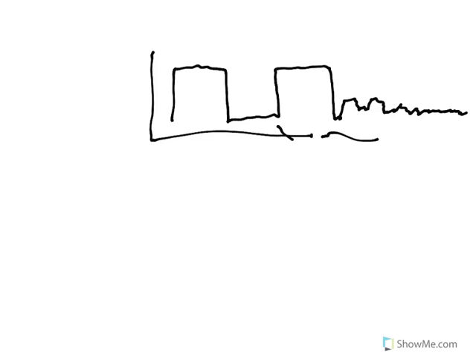And if you notice that you have this poor end-tidal CO2, but everything else looks good, then try a new sensor first. Try a new end-tidal CO2 first. Those end-tidal CO2 detectors can get a little gummed up. So try a new one first. See if that changes.